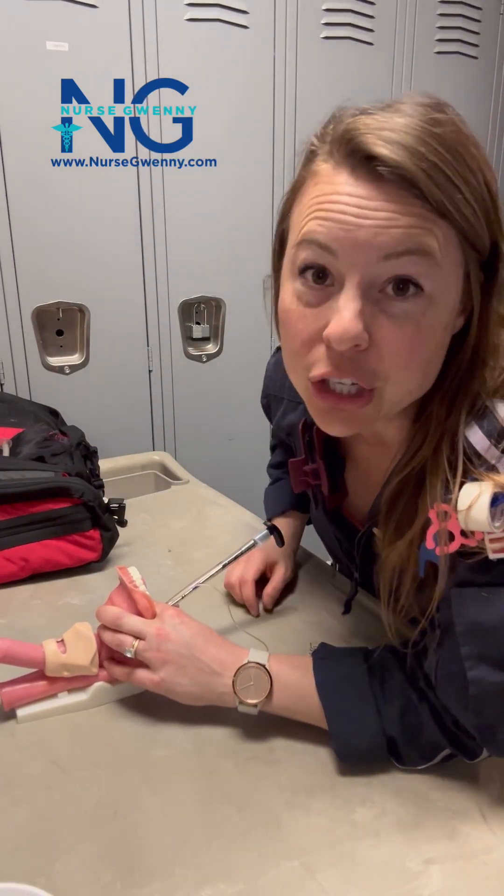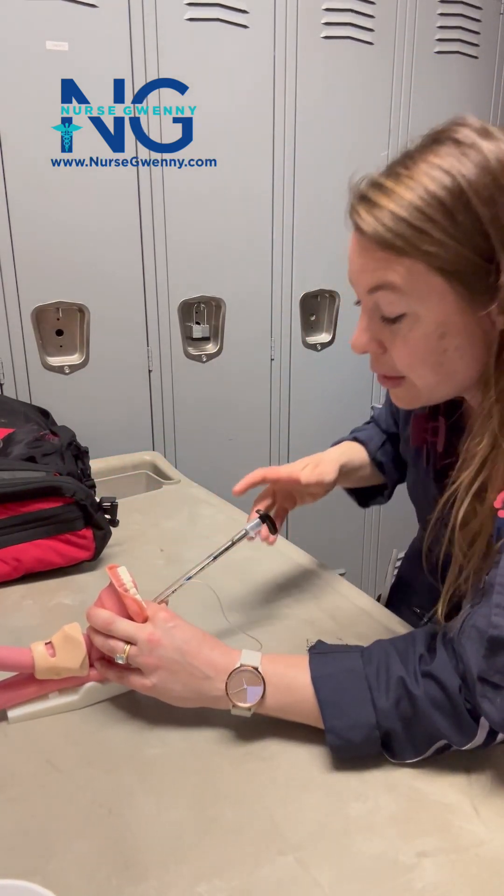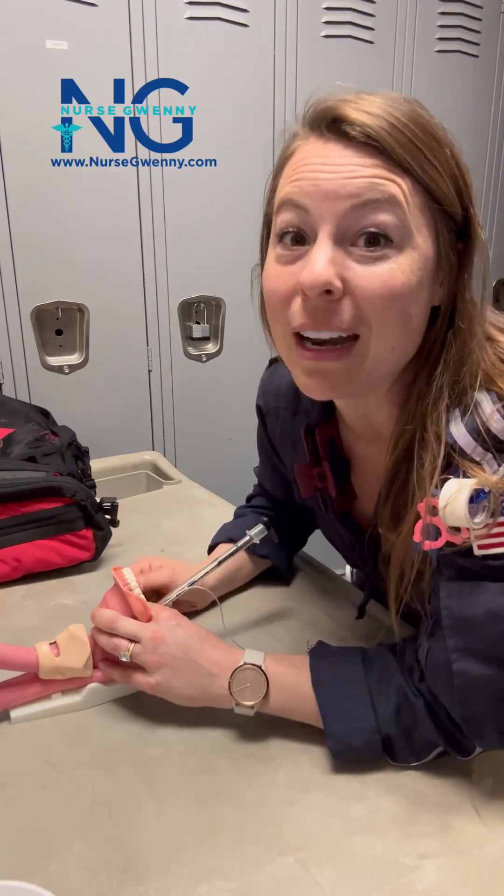So you've got to learn to use this rigid stylet, which is different because the bougie you're holding down here — with the rigid stylet, you've got to control it up here at the top.